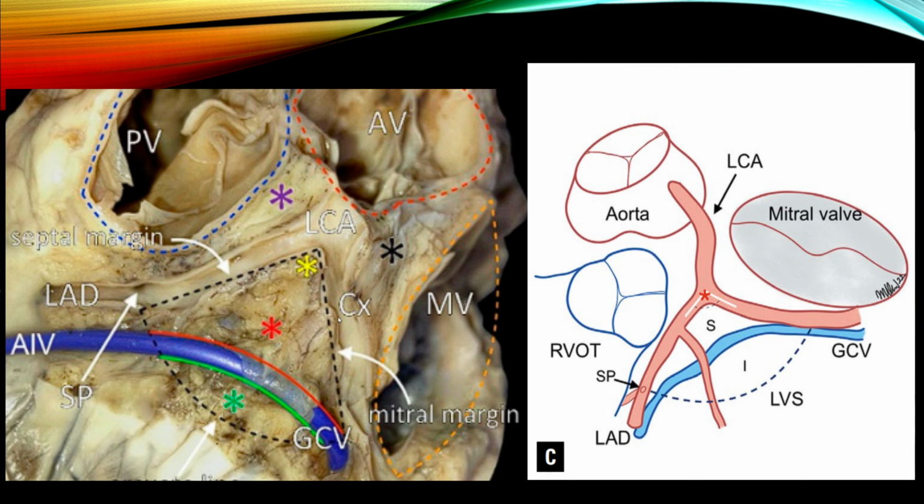This image is of the heart from kind of an anterior, like an LAO superior, LAO cranial view. This yellow dot being the true LV summit, this whole wedge indicating the entirety of it. You can see this smooth tissue here being the coronary arteries, the left main, LAD, circumflex, and you can see our 3 valves, the pulmonary valve, the aortic valve, and the mitral valve. This GCV is the extension of the CS. This is the anterior aspect of the CS, and we ended up ablating right through here and having success.